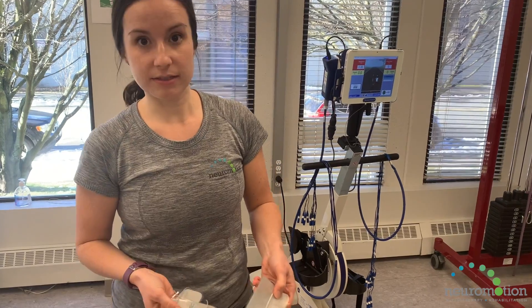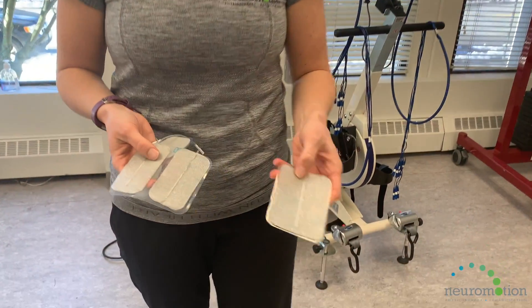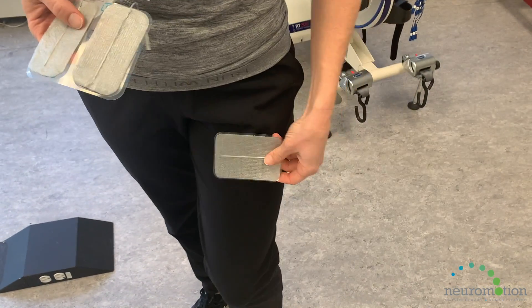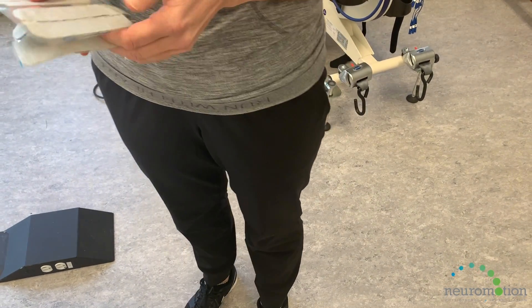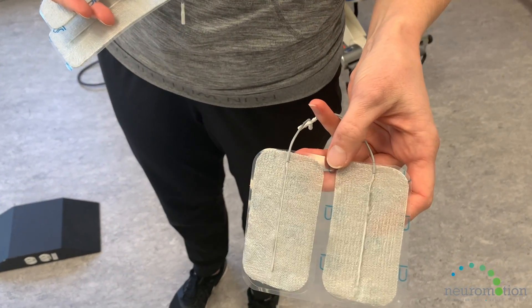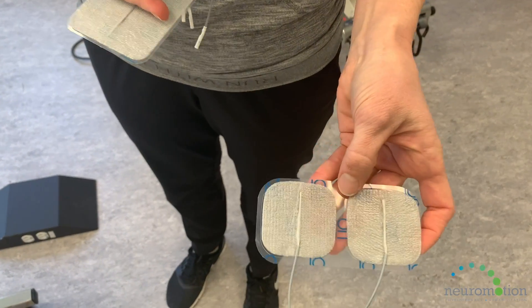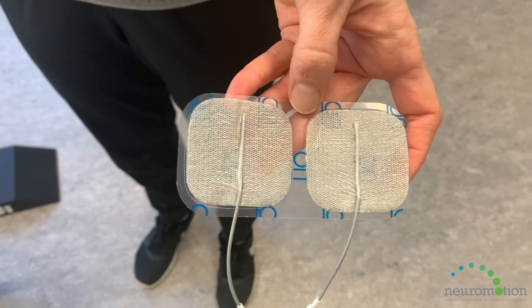There are three different sizes of electrodes that we use. The larger size for the larger muscle groups such as the quadriceps and the hamstrings. There's the medium size for the glutes, the calves, the back or ab muscles, and then the smaller size for smaller muscle groups such as the shin.